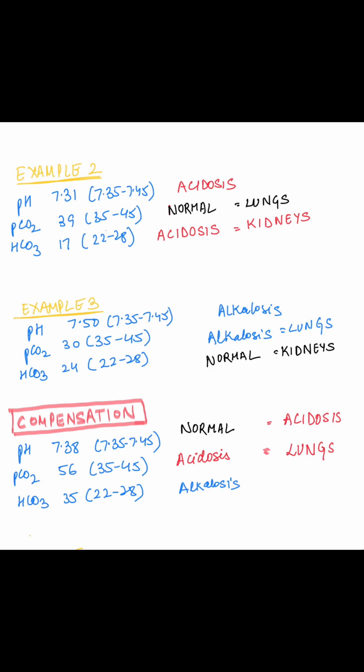So when an acid-base disorder is either uncompensated or partially compensated, the pH remains outside the normal range. In a fully compensated state, the pH has returned to within the normal range, although the other values may still be abnormal. So if both the carbon dioxide and bicarbonates are abnormal, but the pH is in the normal range, look at the pH again. Instead of using a normal range, 7.35 to 7.45, as we have been doing, we are going to use the single value, that is 7.40, as our only normal.